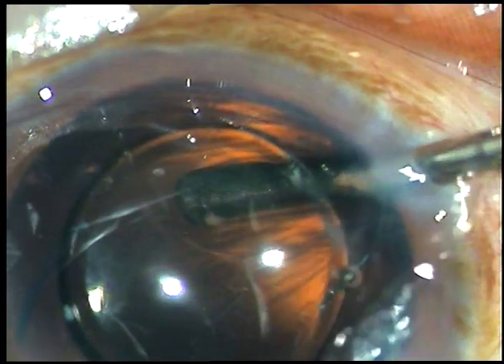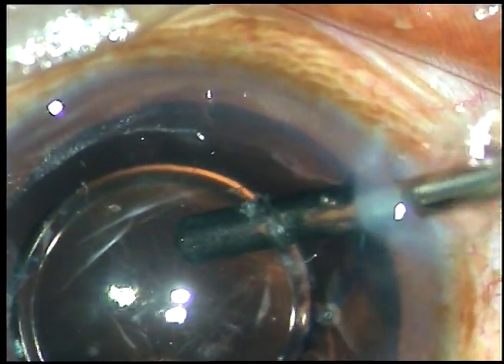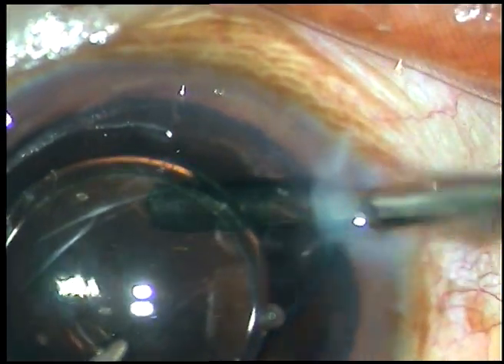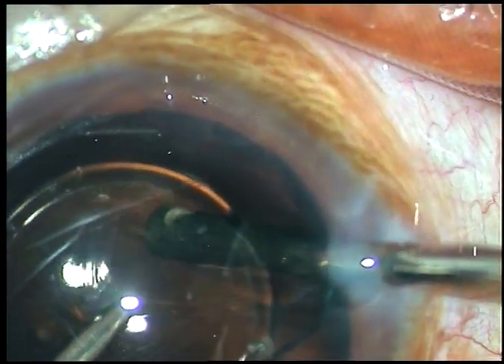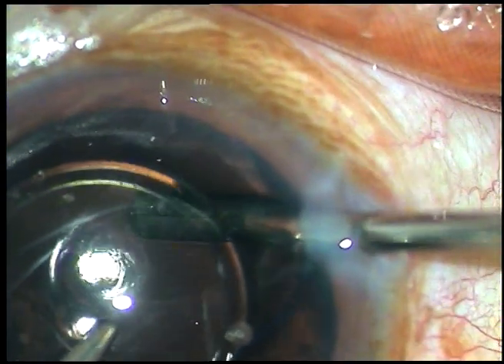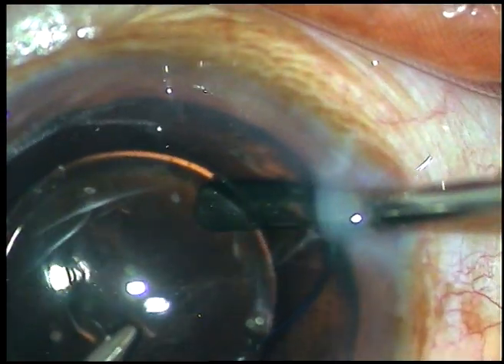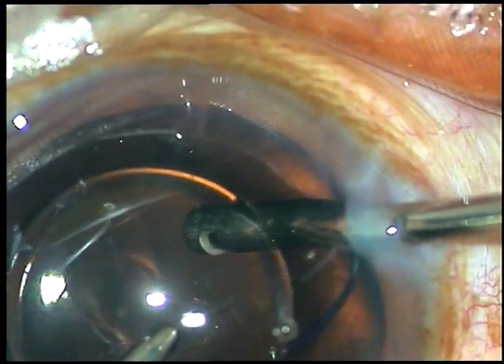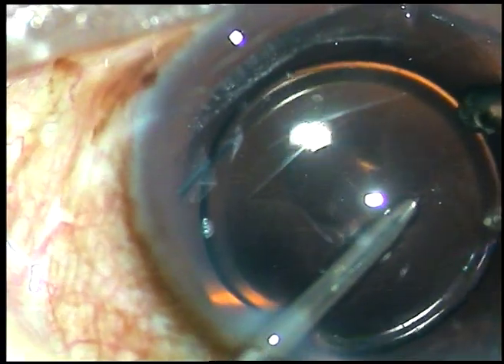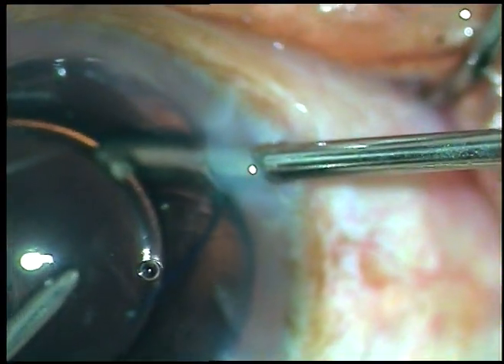I have gone about three millimeters or so posterior to the posterior capsule, into the anterior vitreous through the side port made at around 8 o'clock. Now I am cutting and aspirating whatever comes to the cutting port of the vitrectomy cutter. The vitrectomy cutter is from Alcon; the machine being used is Alcon's Accurus. It has 2,500 cuts per minute and I am using 150 mmHg vacuum and 1,500 cuts per minute.